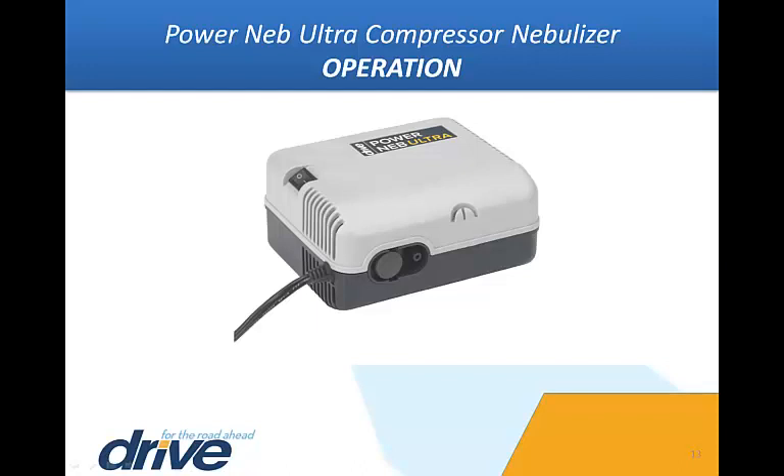Operation. Caution: the nebulizer is designed for intermittent use only. Do not operate continuously for more than 30 minutes for a single use without turning it off and allotting for a cooling period of at least 30 minutes.